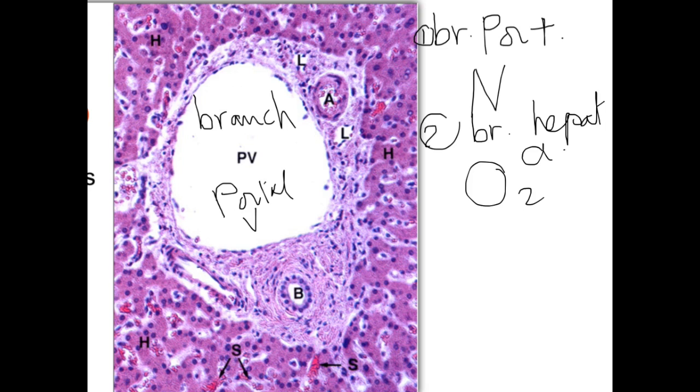Then we have here a lymph vessel, like a capillary lined by flat endothelium, flat squamous cells, and white inside, containing lymph, which is not stained here. So we have the lymph vessels. Number three, we have lymph vessels for drainage of the lymph from the hepatocytes.